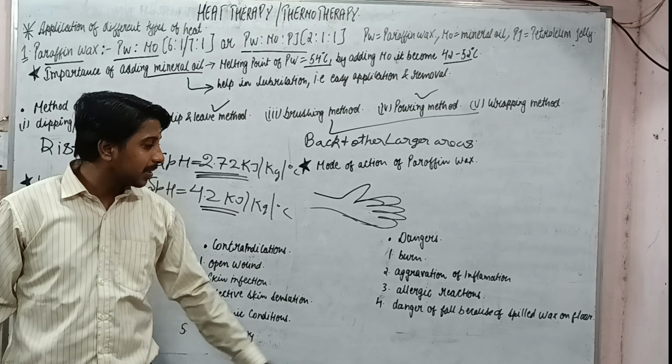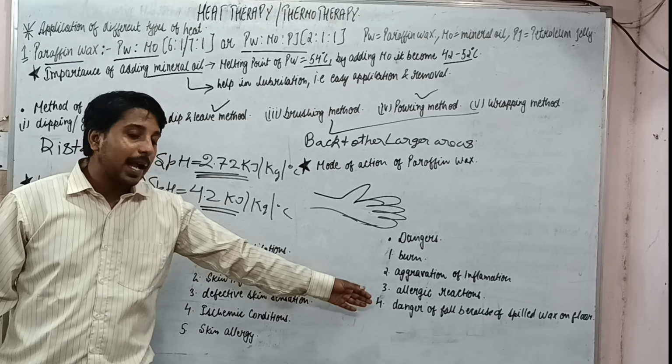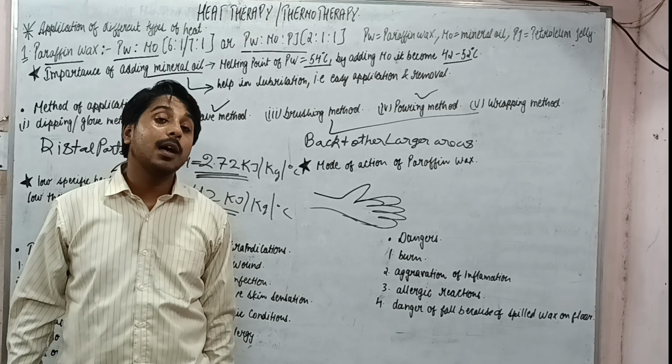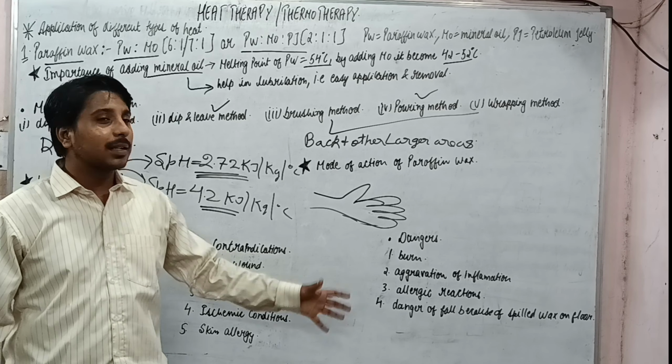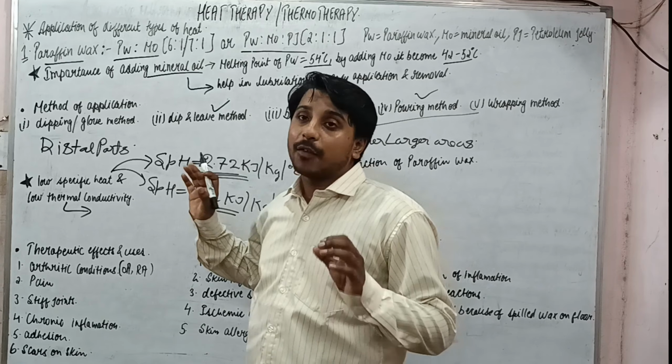Dangers are burns, then aggravation of inflammation, allergic reaction, and if there is spilling of the wax, it can also cause slipping and a fall can occur. So these are some basic things that you need to understand about the paraffin wax.